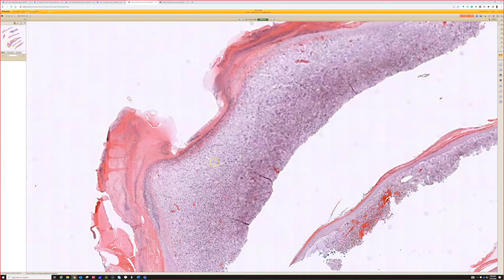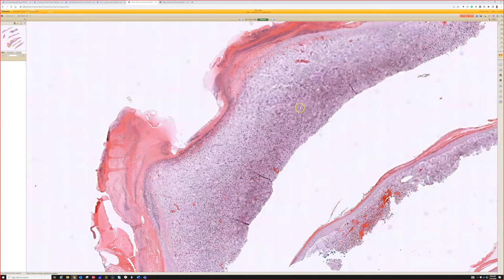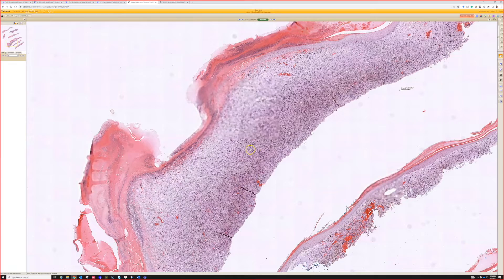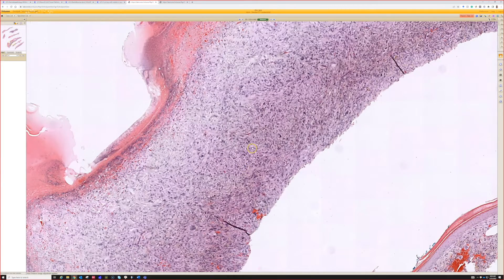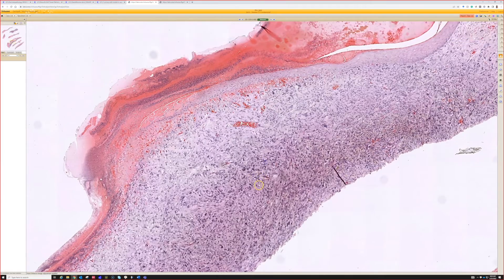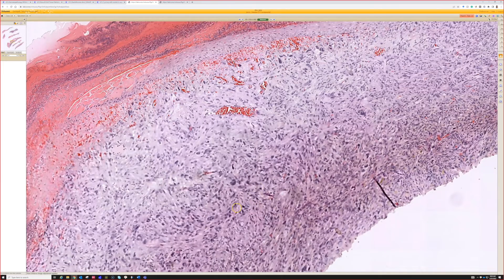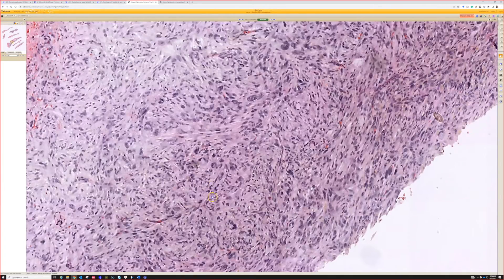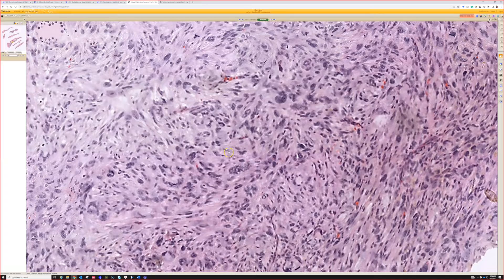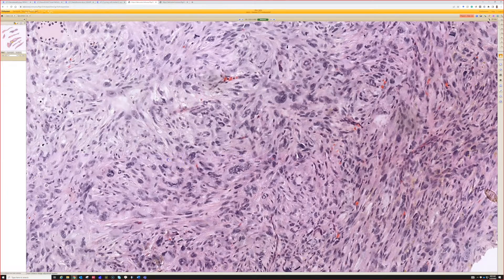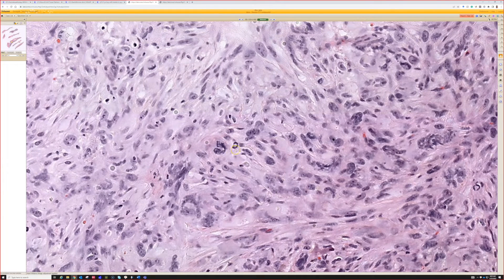But then we see a lot of very hypercellular population in the dermis that consists of very pleomorphic spindle-shaped cells. And I saw a lot of pleomorphism. And I saw mitosis also.